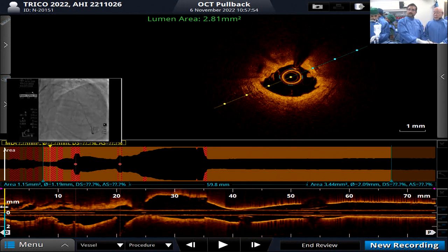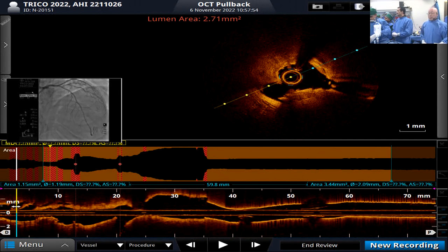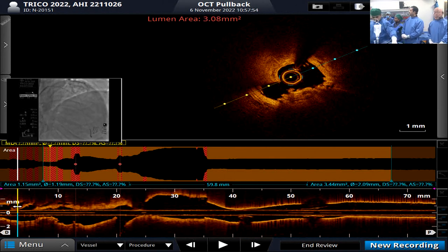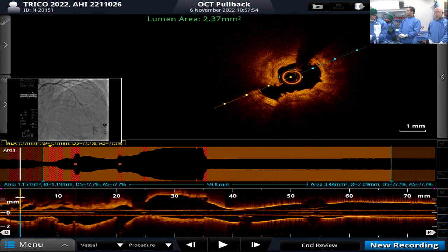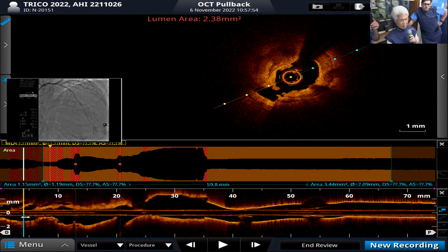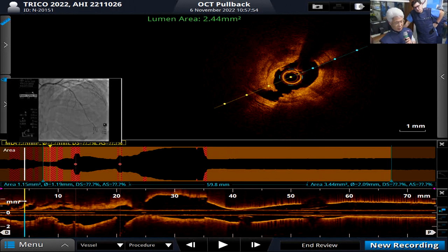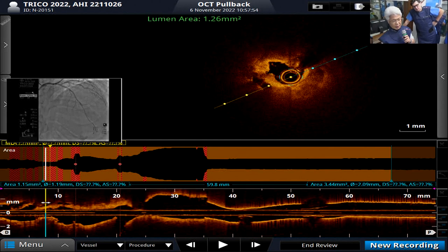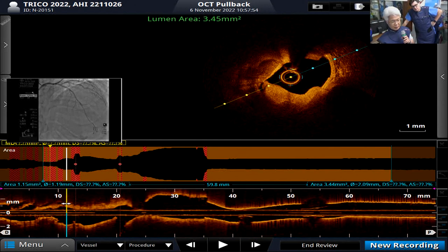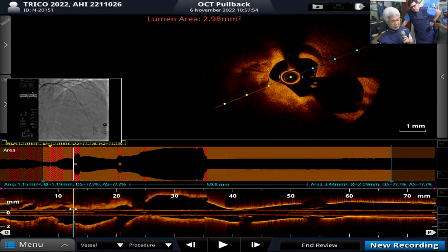Here is the distal portion, still there is some disease, right? And this is the dilated portion. You can identify the dissection, right? Here is the adventitia, or it might be very limited. It's a long dissection on the angiogram. I thought it was streaming, but now it looks like a dissection, right? All the way down. Some pretty good calcium there too.